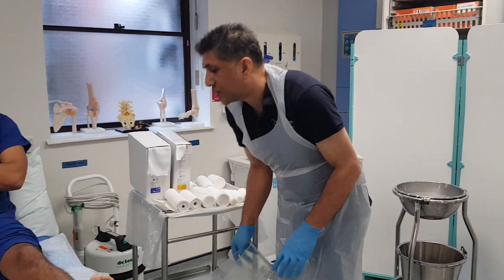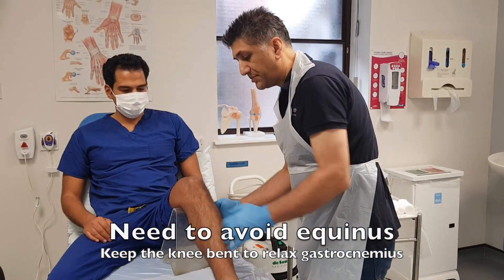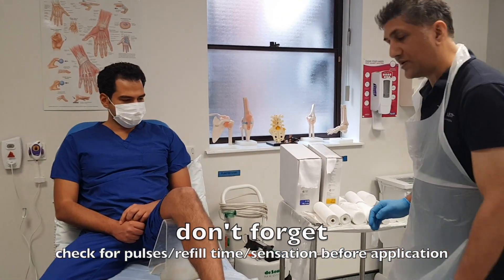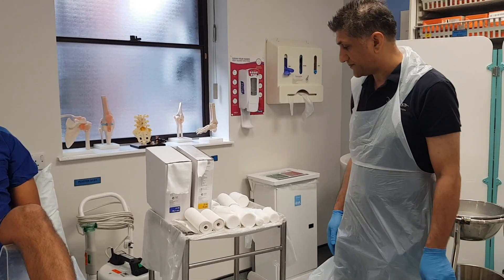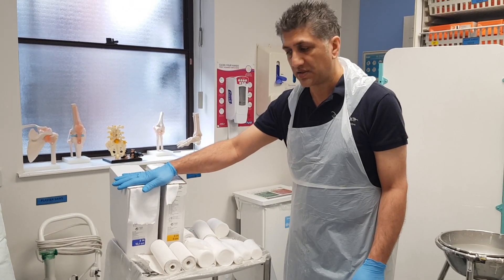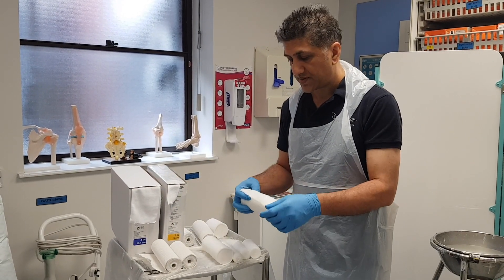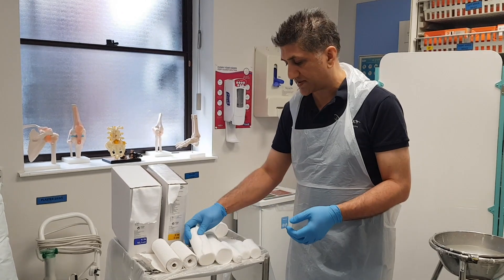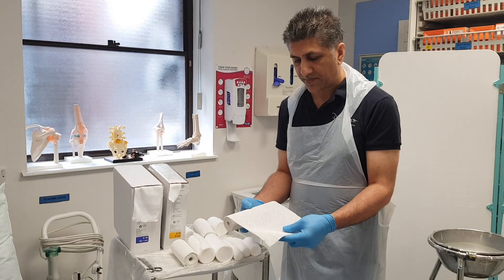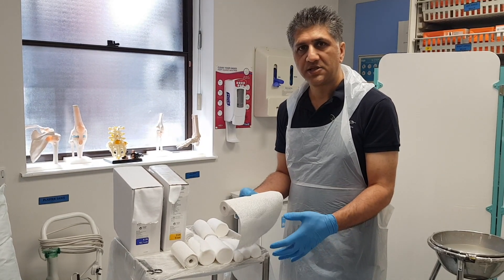In order to do that, I'm going to lift up his knee and keep the knee bent. I've got all my materials here ready: a stockinette which is the comfort layer going next to the skin, some wool which is going to protect the skin from the plaster, and some plaster slabs.